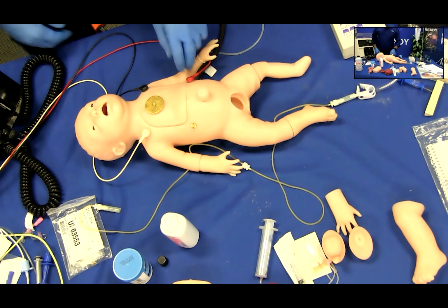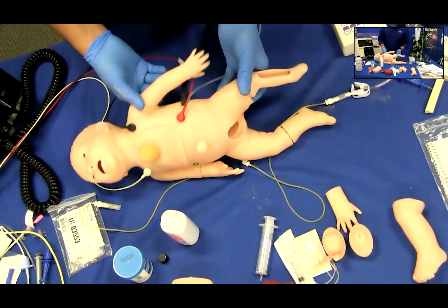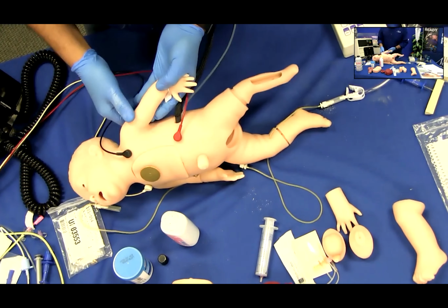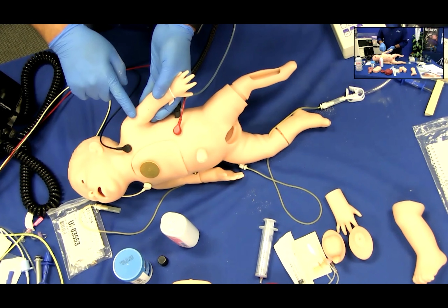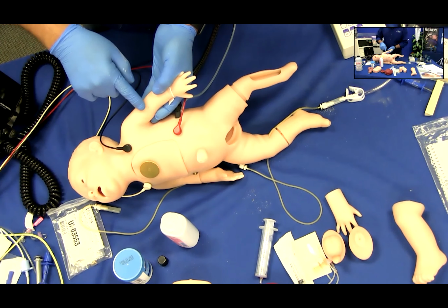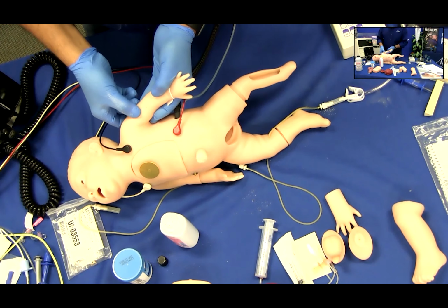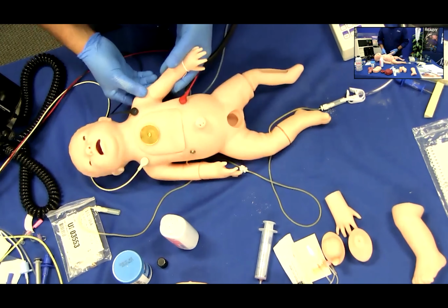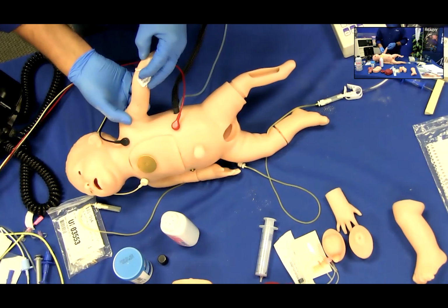The left arm of Charlie will accept a 2 French catheter via the molded access site. Lubricate the PICC thoroughly with a supplied lubricant before insertion. This site is intended for practice site insertion and care only. Do not attempt to infuse fluids through the PICC line.